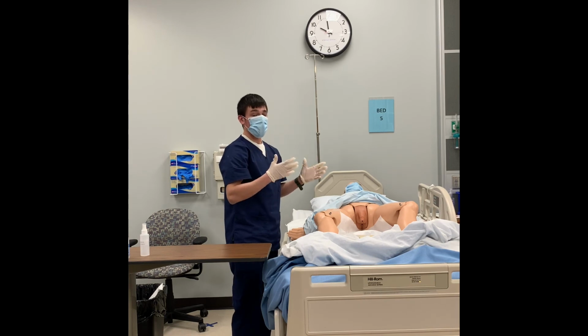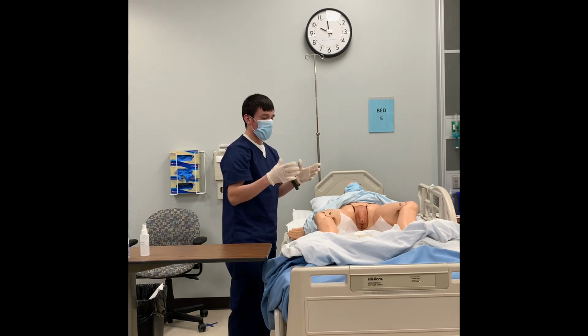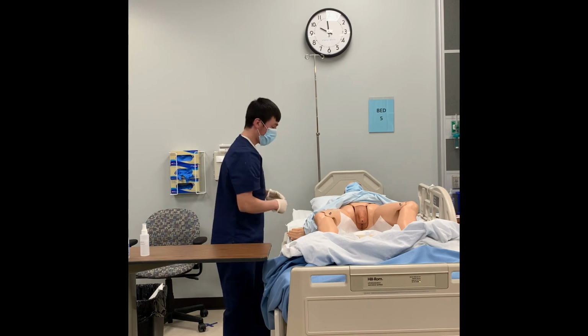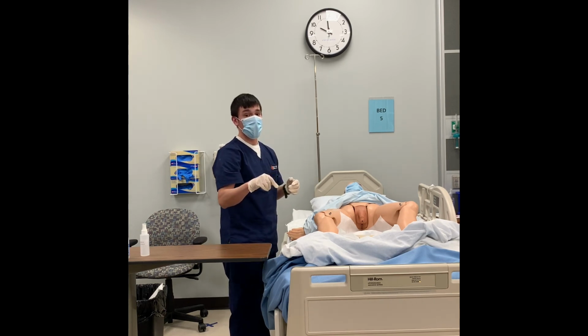Before I would actually leave, I wanted to show this at the end, that way I didn't have to address it twice, but before I would leave, I would make sure that the bed rail is up, and then again, same thing, cover him up and lower the bed before leaving.